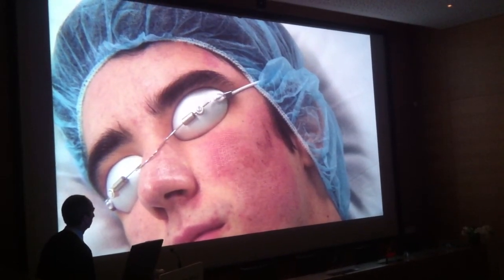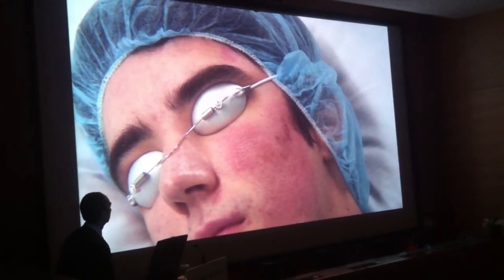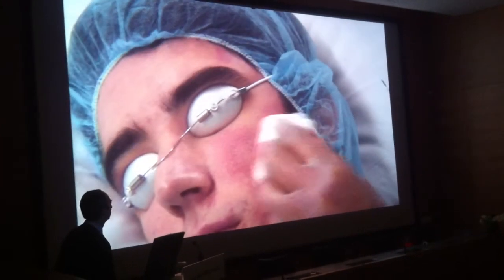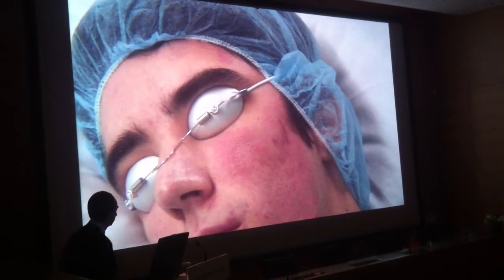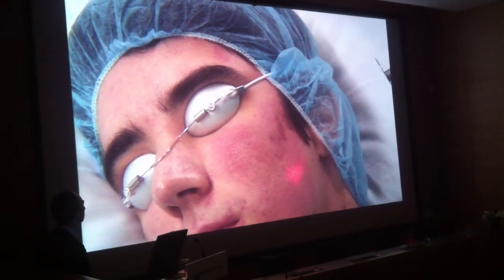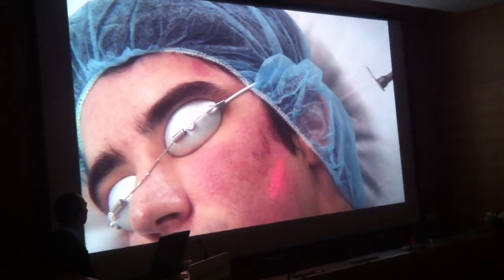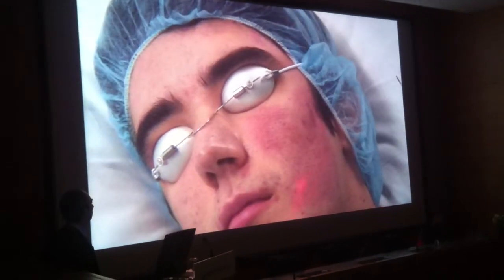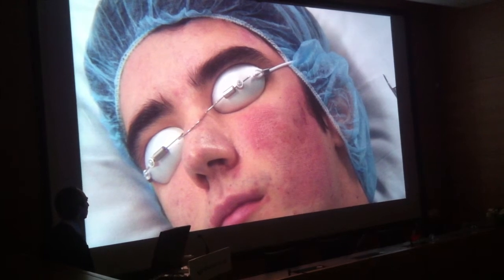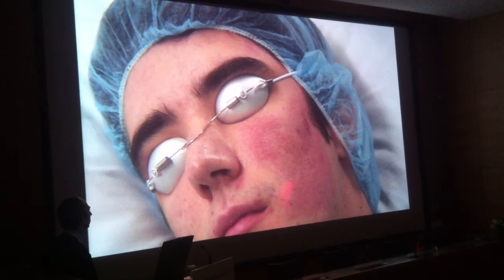I know it sounds funny to you, coming from a surgeon, you think we are much more aggressive, but it's not always like that. And what I also like is that, as you can see, the skin has shrunk already, but the aggression has not been very extreme. And so if I do another pass now, which would give me more tightening and more bulk heating in the superficial layers of the dermis, I would definitely not have a much longer downtime.